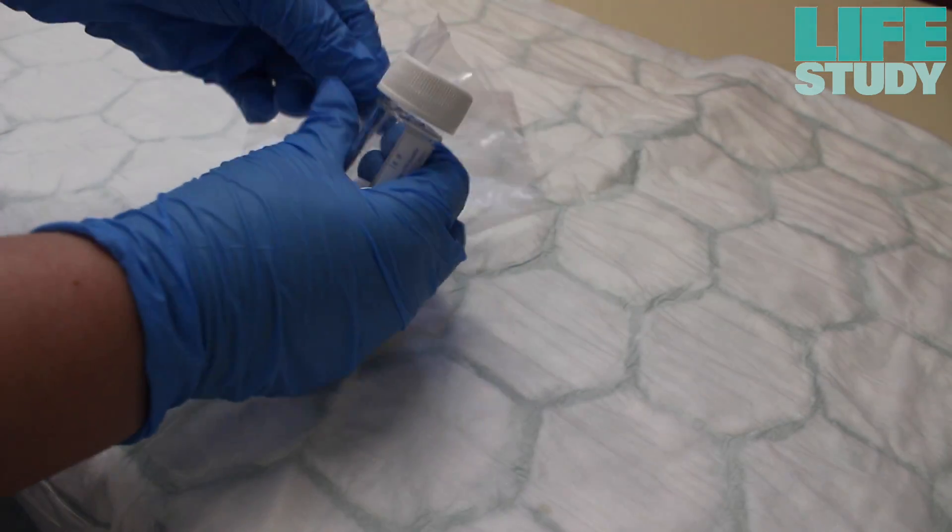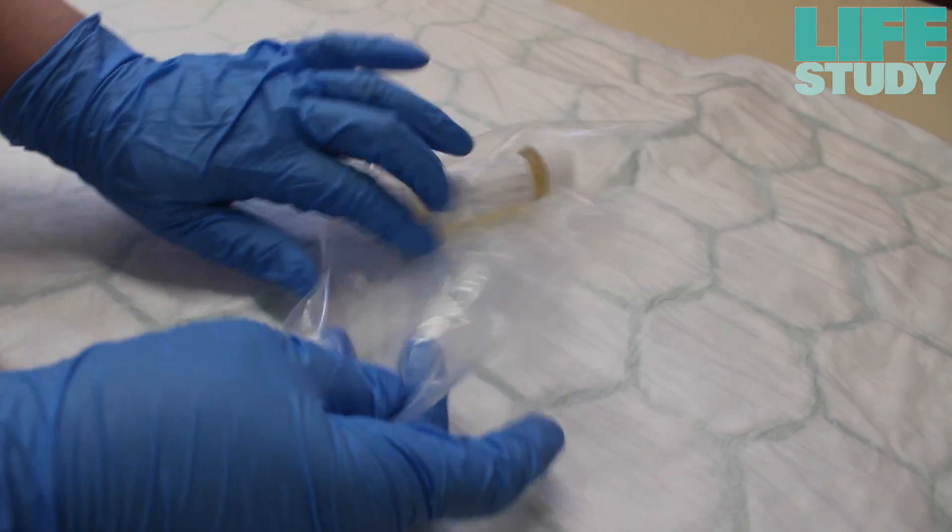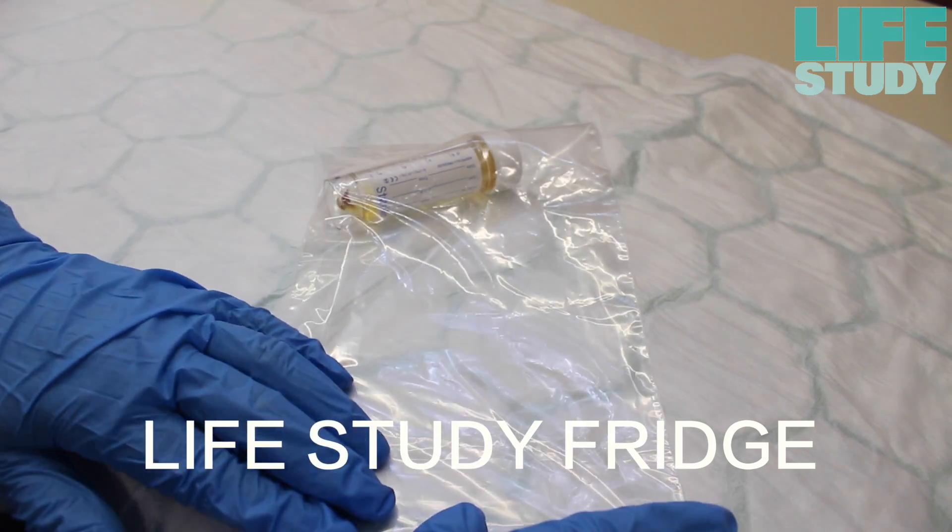The collection tube should be placed into the second Ziploc bag provided. Then the sealed Ziploc bag containing the sample should be placed into the Life Study fridge on the labour ward.